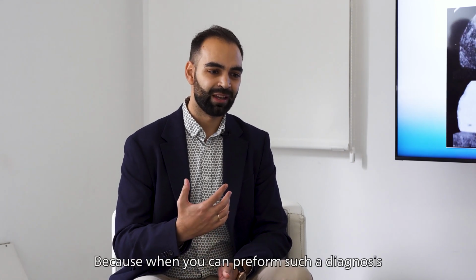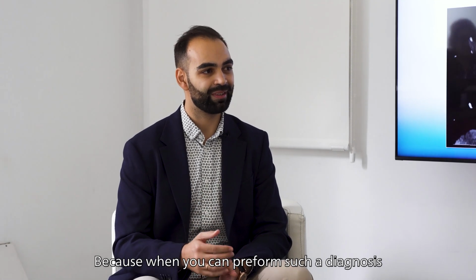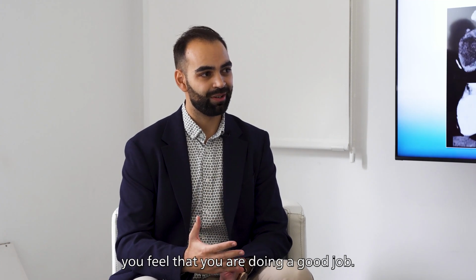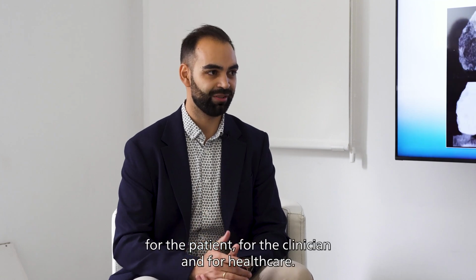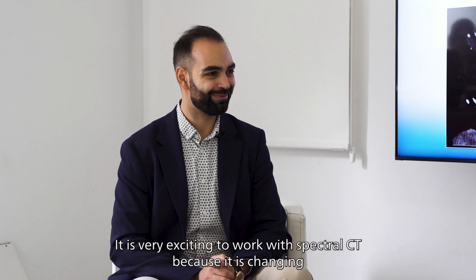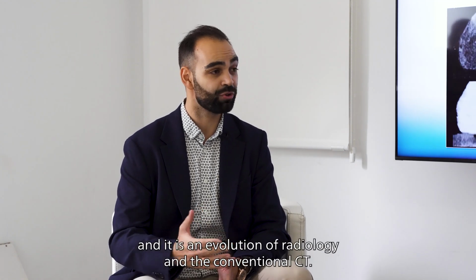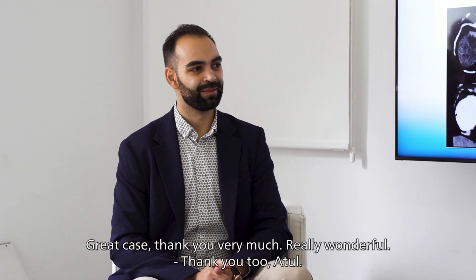That's because when you can perform such diagnosis, you feel that you are doing your work well. You are doing the best for the patient and for the clinician and for the healthcare. So for this reason, we are happy. It's very exciting to work with the spectral CT, because it's an evolution of radiology and the conventional CT. Great case. Thank you very much.